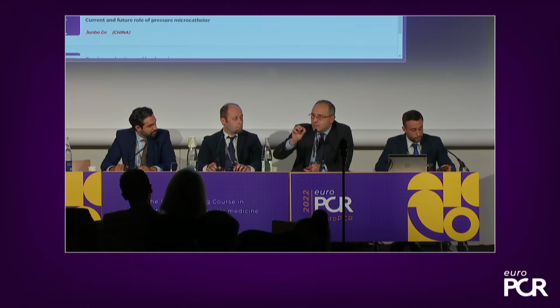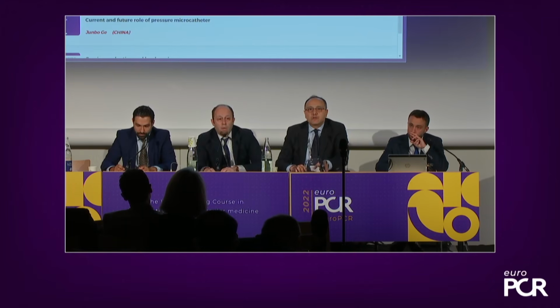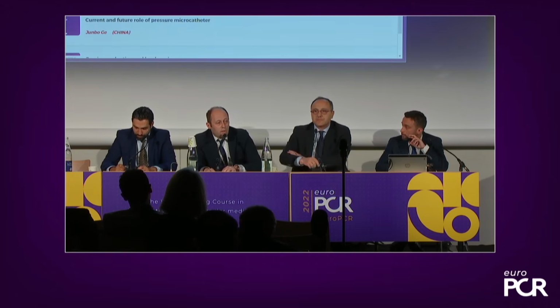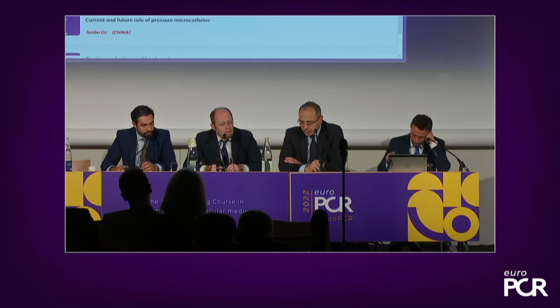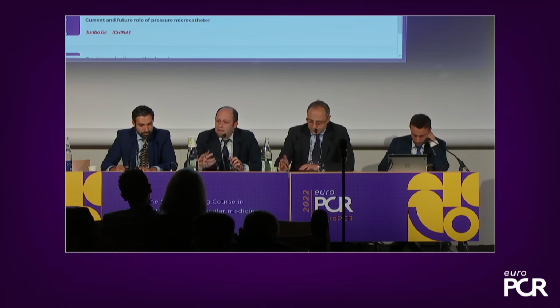But we ended up with 2-3 millimeters mercury drift after a procedure of 1 hour and something. So it's quite good. By the way, if there is anyone who wants to comment, or otherwise, Emanuele, I can ask you a comment about residual disease after stent implantation, because I believe it's a very important message for all the people that it is not a failure of PCI technique.